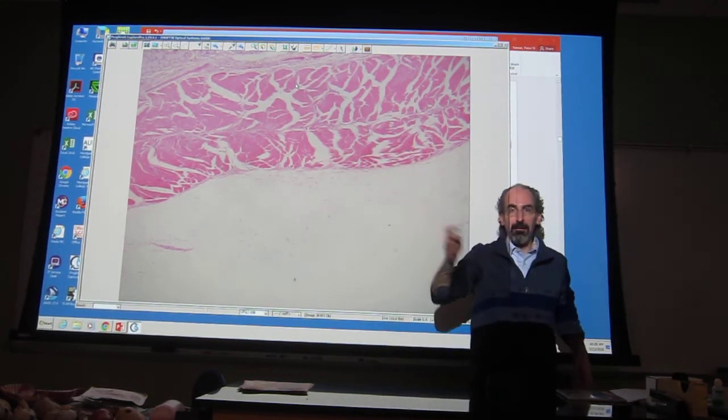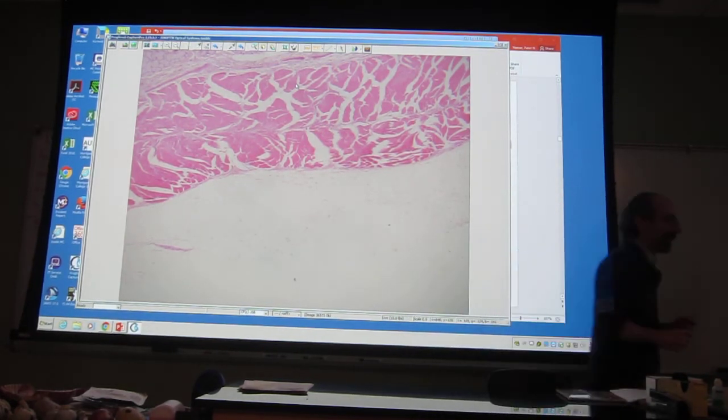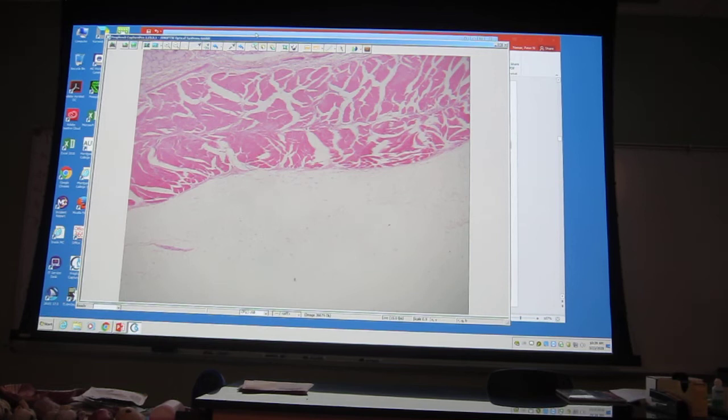Like I said, not everyone may agree with me. I'm not perfect with the histology, but that's how I would call it. If someone else thinks differently, I would appreciate hearing their opinion.